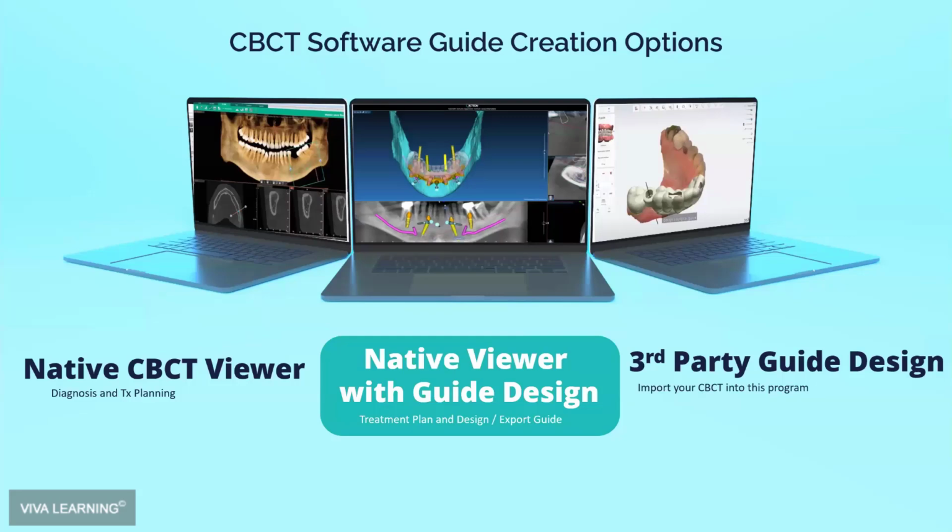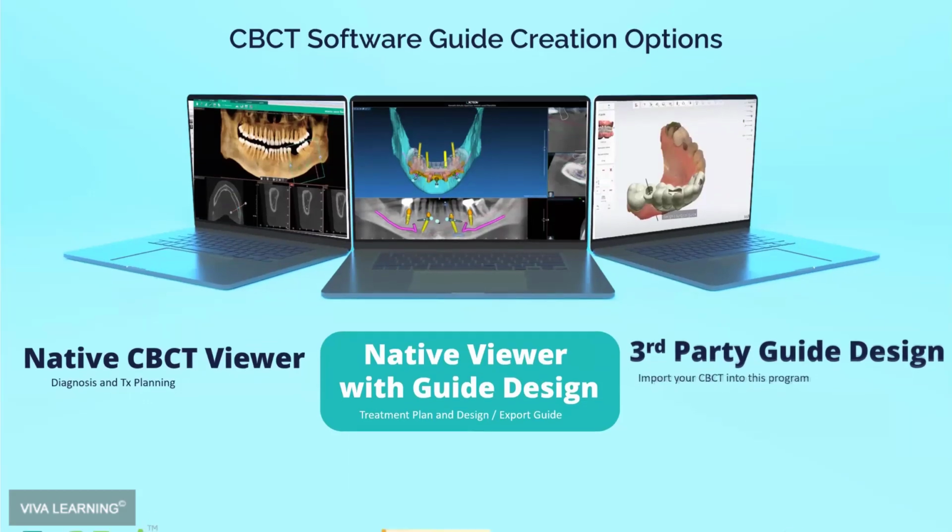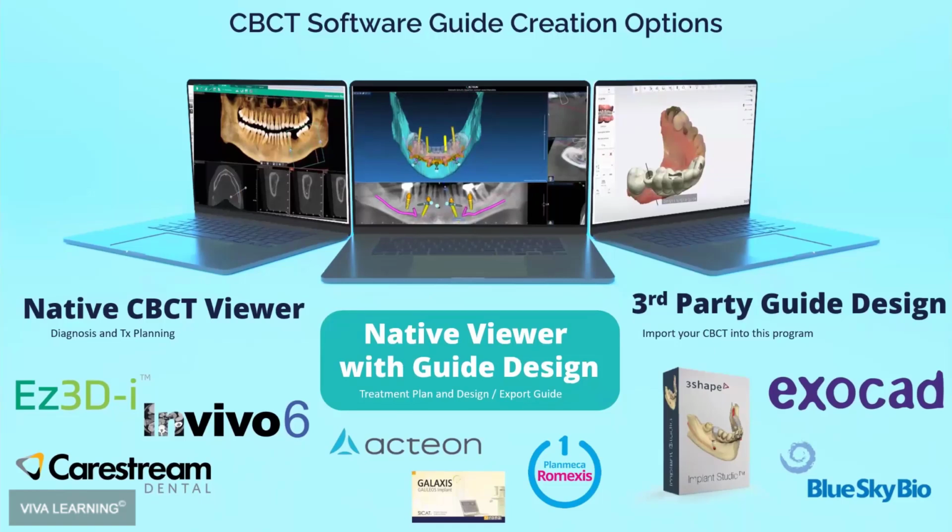The middle one is the native viewer that also has guide design built in. So now not only can we treatment plan implants, but we can actually fabricate some things in here. We can design and fabricate some things for export and then either 3D printing or milling or send it to a lab. And then on the far right is the third-party guide design, which is things like Blue Sky Bio, ExoCAD, 3Shape.